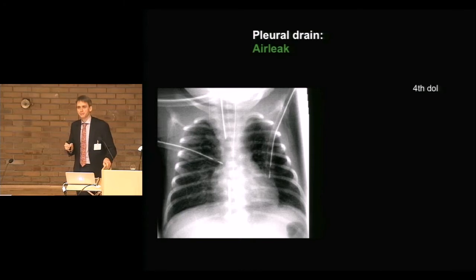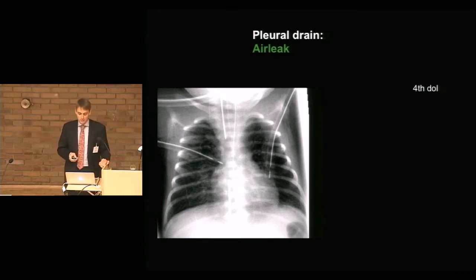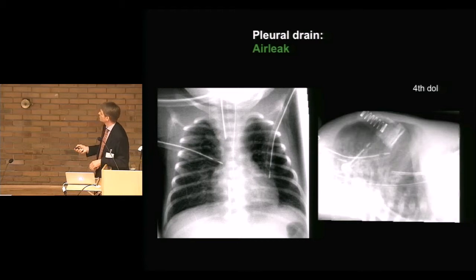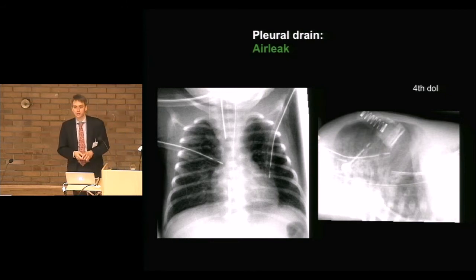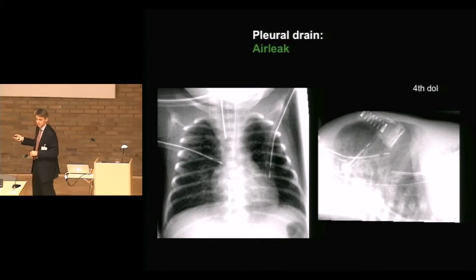So the problem with pleural drains from my point of view always is if you only rely on one plane. If you're not sure about the right position of your pleural drain, you should always consider a lateral view, and a lateral X-ray showed the two different drains here, which are either coming from here, here's the head from this lateral view, and the other one coming from here. So now the question is, is this drain in the right position or not? Who would still vote for the right position of this drain? Who's thinking that's in the right position? What do you think? This one is inserted very high here at the second intercostal space. It's very high, that's true.